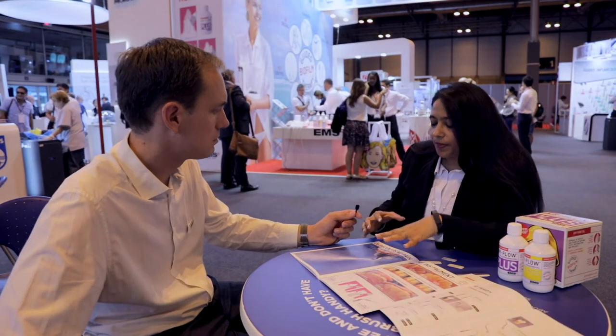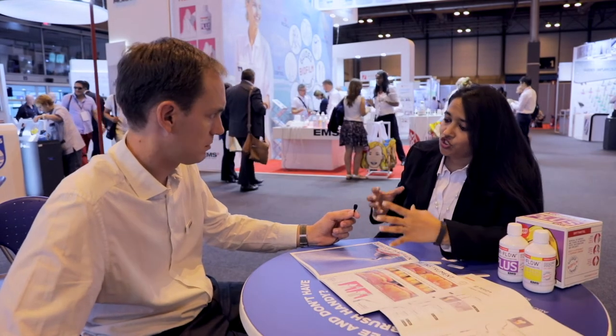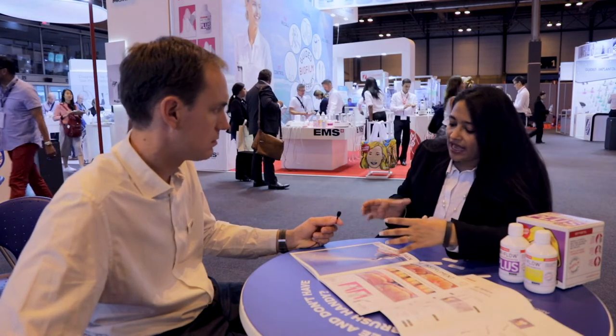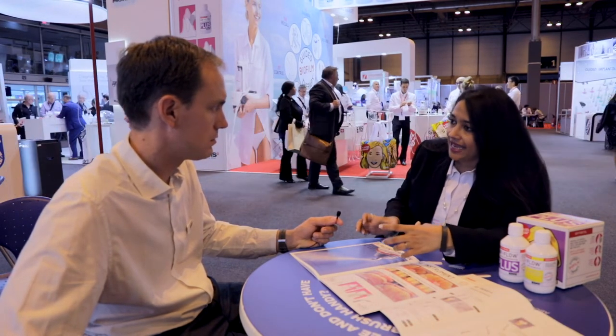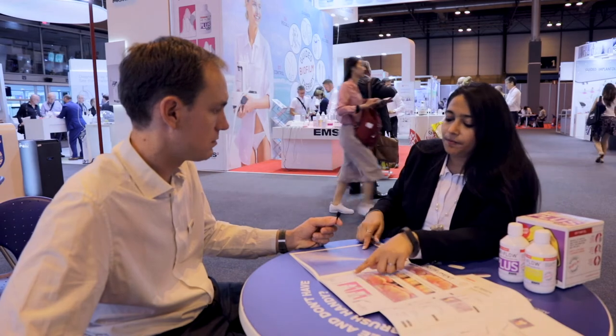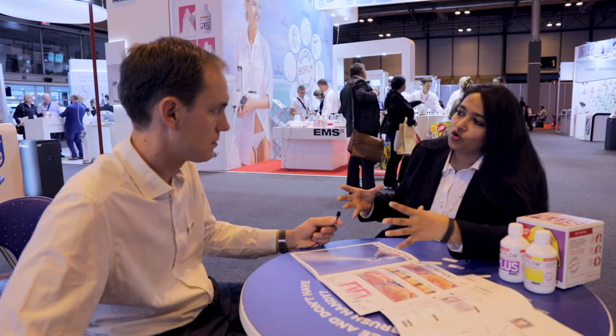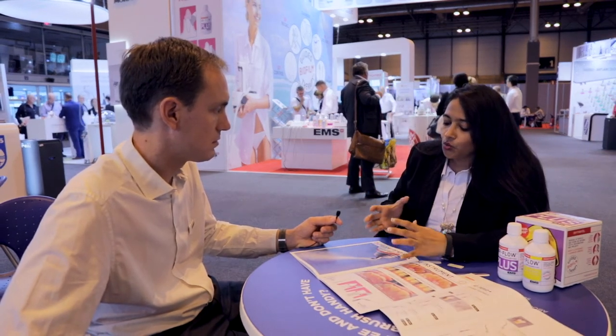What do we mean by Piezon No Pain? Piezon No Pain is actually a system which comprises three essential components: the electronic module, a very specialized handpiece, and the PS instrument, which are designed in combination in order to give you the no pain module. The entire module works on what we call the dynamic response.